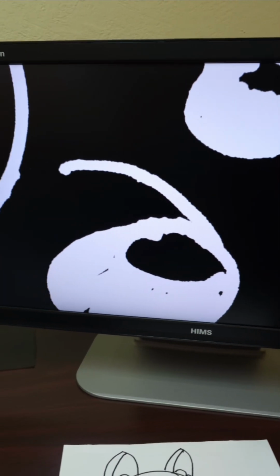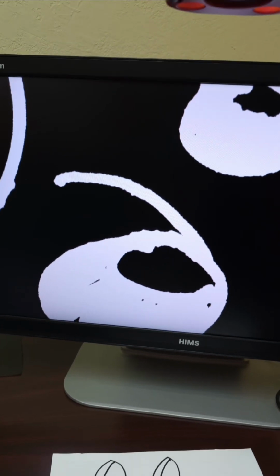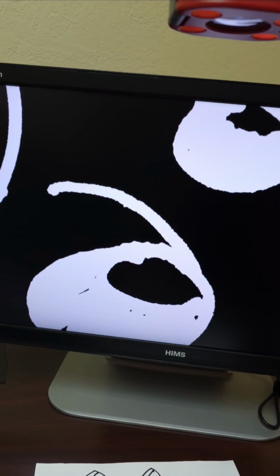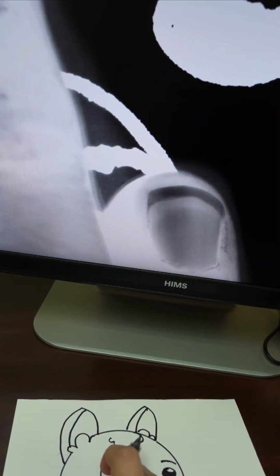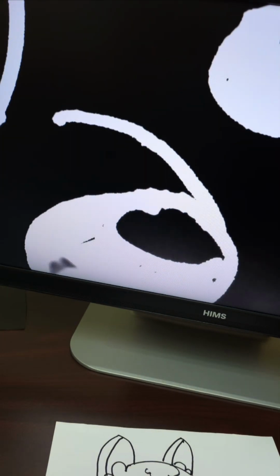because I have such a small field of vision that I have to kind of pull things away so I can see more of them in my central vision that I do still have. But then that means I lose a little bit of detail. So now when I come here, I'm gonna find my place here. You can see my hand zoomed in there because I've got my pen close.